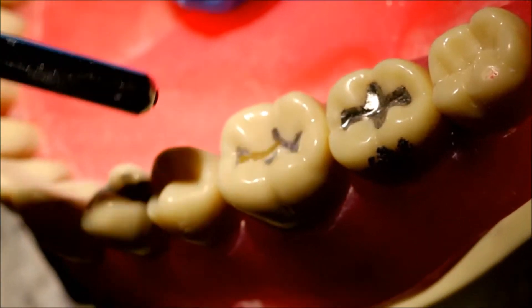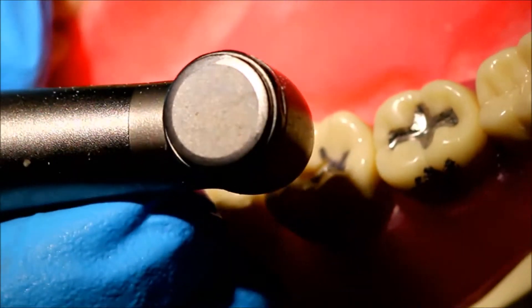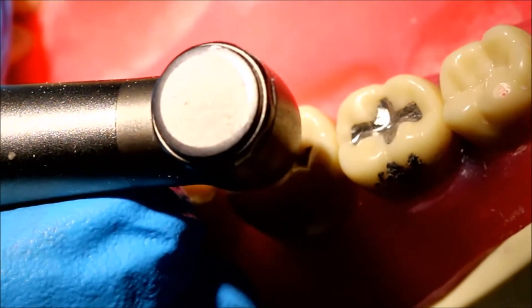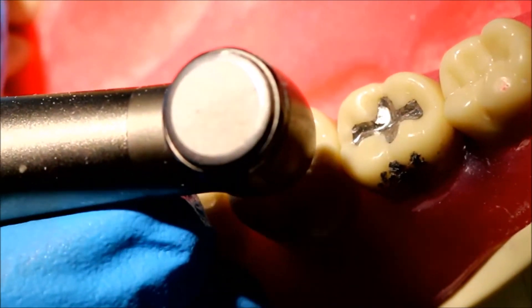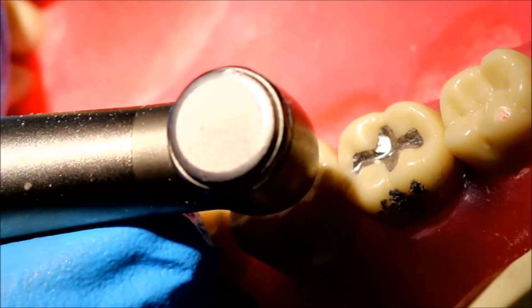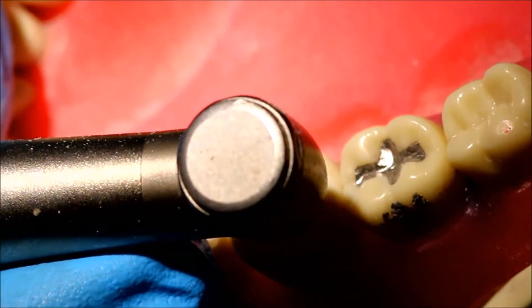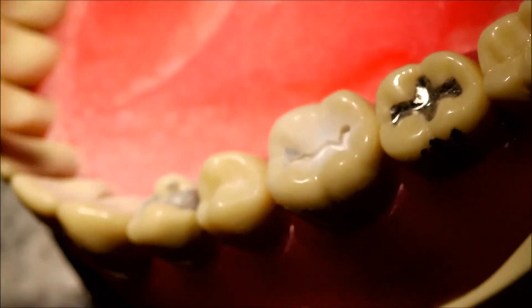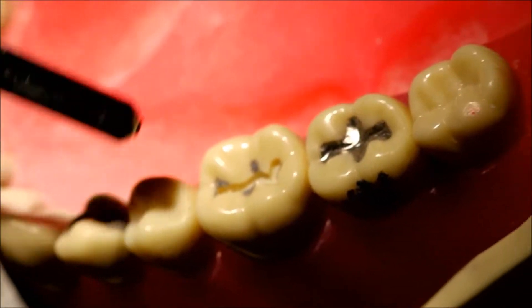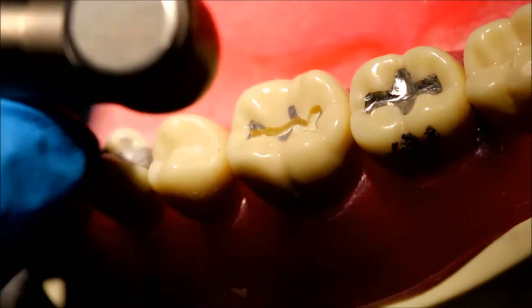I've gotten to about half — I'm going to clean it every time to make sure that I'm not missing my groove. I'm going to continue taking it all the way to one of my fishtail extensions. Once you have your central groove taken all the way to one of your fishtail extensions, remove the handpiece and clean out everything that you've prepped so far, making sure there are no grooves missed.